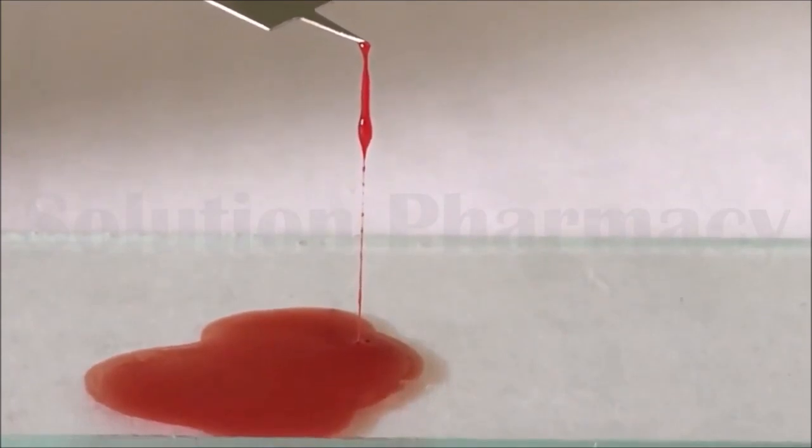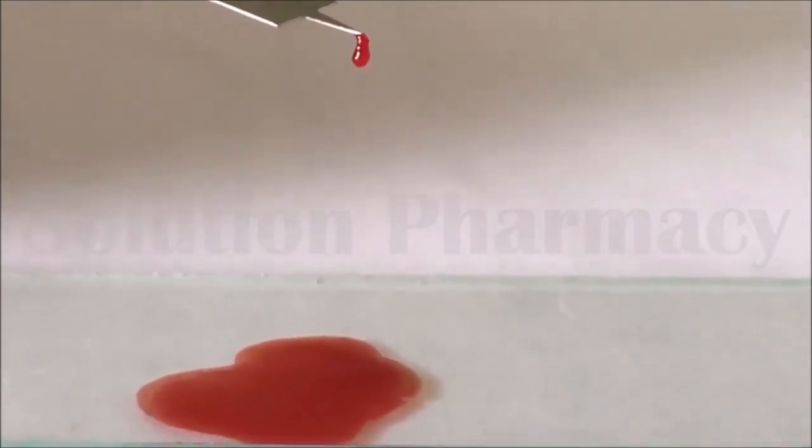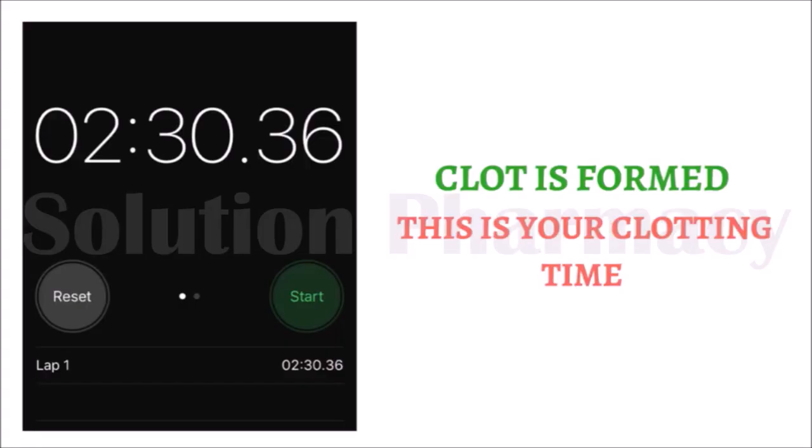Clotting time is the time at which clot formation takes place, or you can say the time required for a blood sample to coagulate, meaning to form a clot, and it is the time interval between the appearance of blood in the finger and the formation of a thin fibrin thread, meaning a blood clot. Finally, this is the clotting time of our blood sample, that is 2 minutes and 30 seconds.